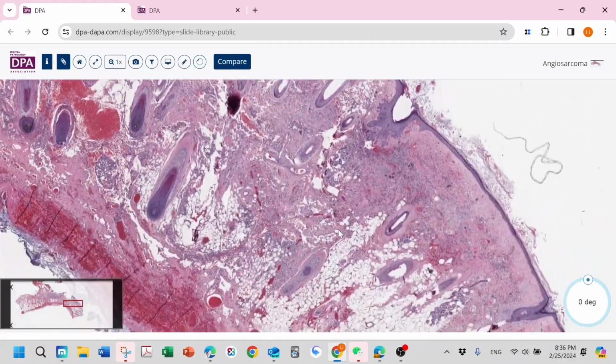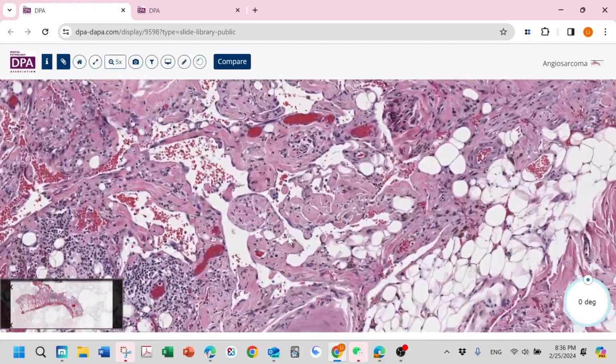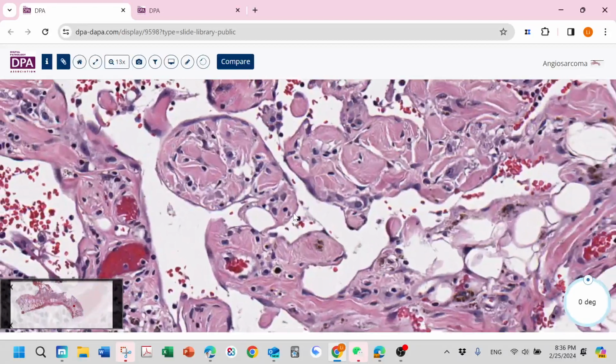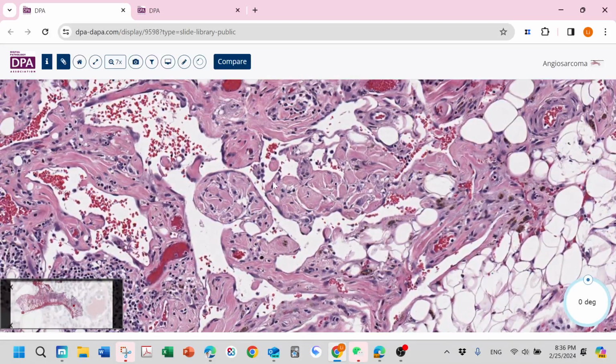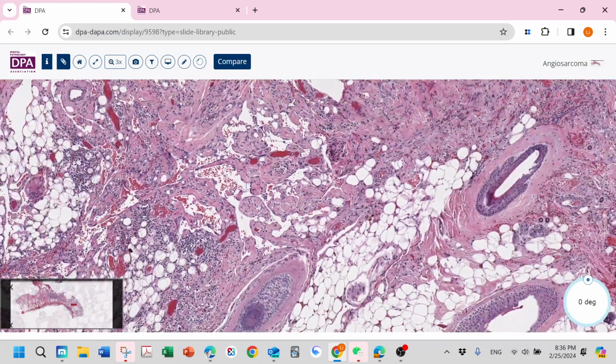Let's see one characteristic feature, just this endothelial cell just dissect the collagen bundle to form this almost like papillary structure. I think you still remember when I was talking about the papillary endothelial hyperplasia, but in that lesion, you will find all this structure just inside a big lumen of a thrombosed vessel.